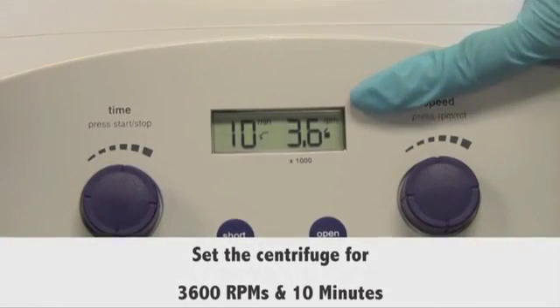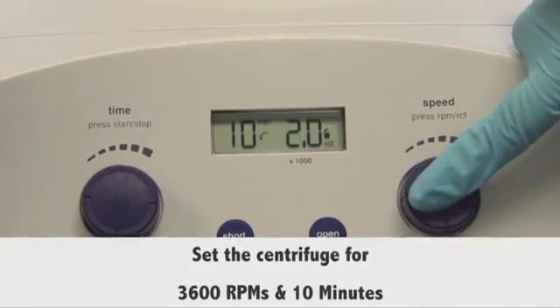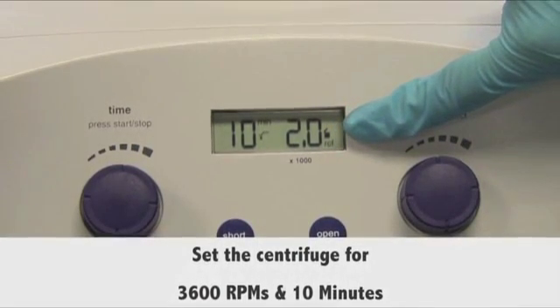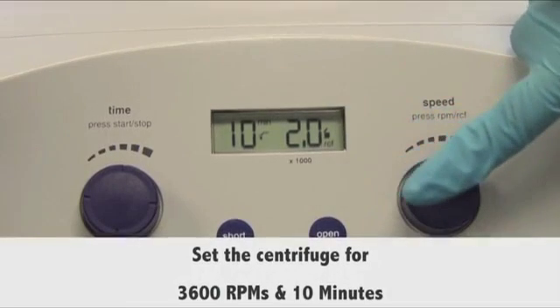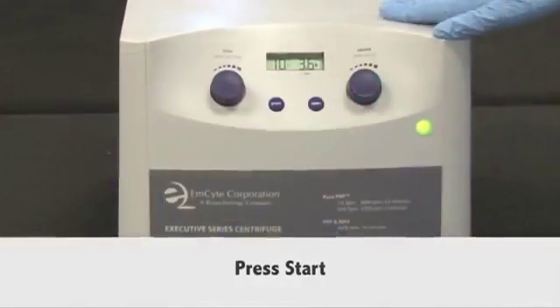Set the centrifuge for 3600 RPMs and 10 minutes. This is the equivalent of 2000 g's. Push the speed button to toggle between RPMs and g's. Then push the start button, located on the left.